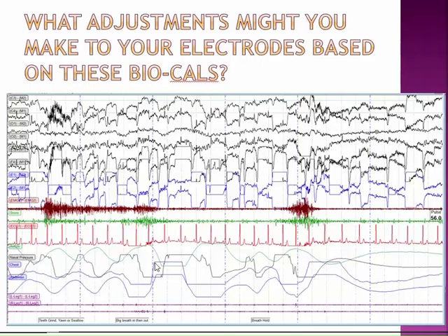When you see it block off, it means they took a deep enough breath that we don't have these channel properties set appropriately to see the full nature of their breath. So we would need to decrease the gain, or decrease the height, or decrease the amplitude of those waveforms.